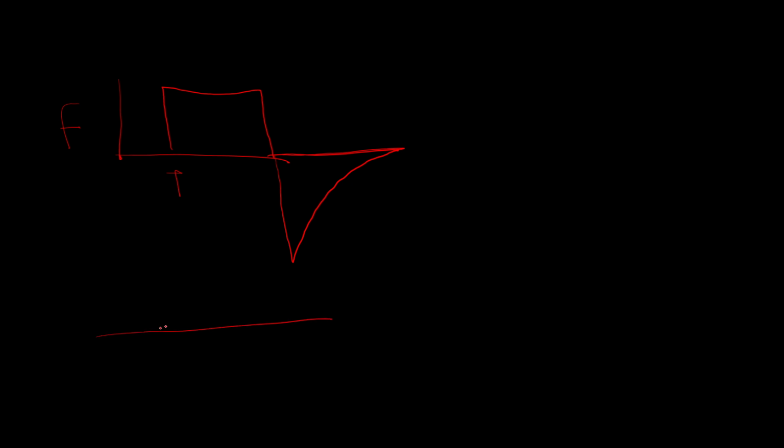If you see a sinusoidal pattern, this is mostly seen in spontaneous respiration. The small deflection below the baseline here is the trigger, that is the negative trigger. You may have an exponential decay or decelerating pattern, which is seen in pressure control. This is in volume control, and this is the spontaneous. These are the flow patterns we will see in the ventilator graphics.